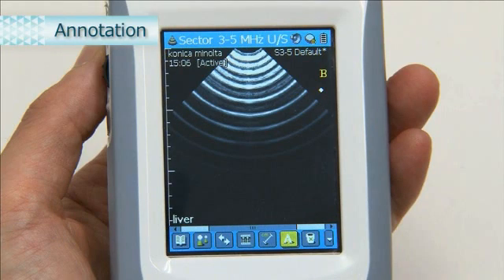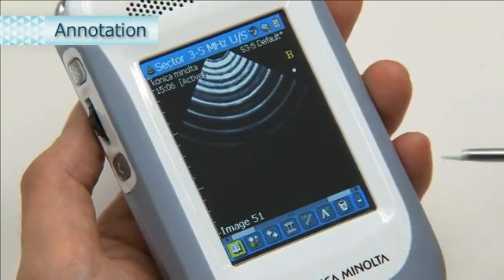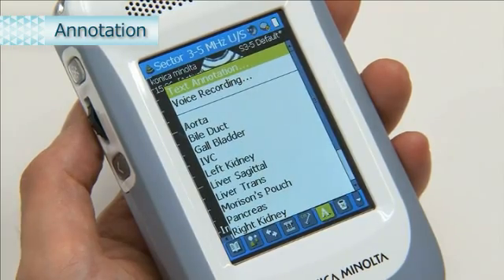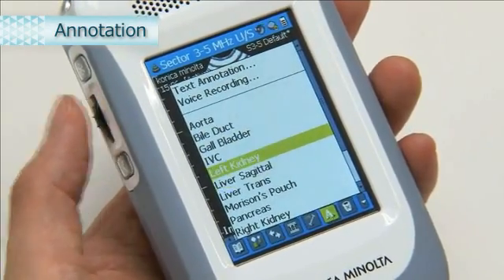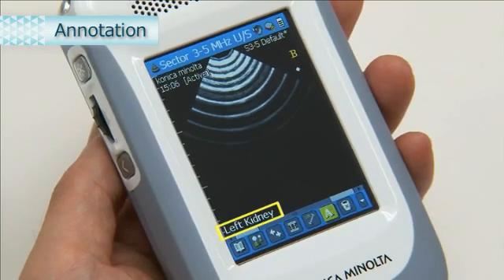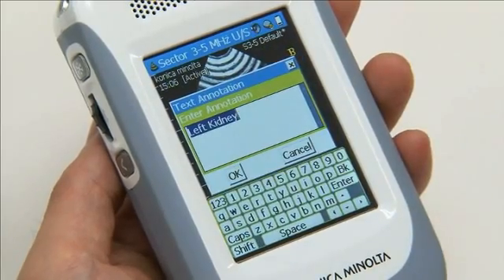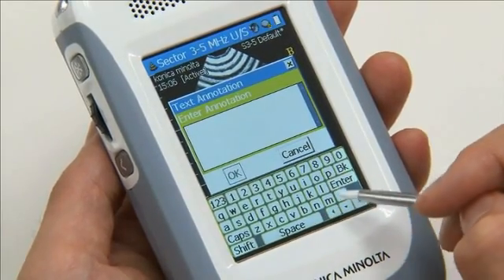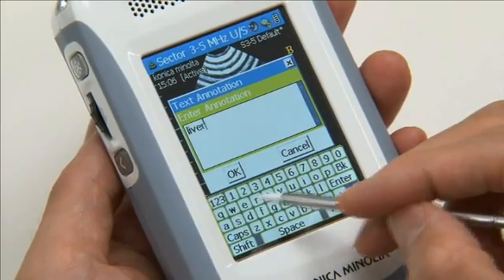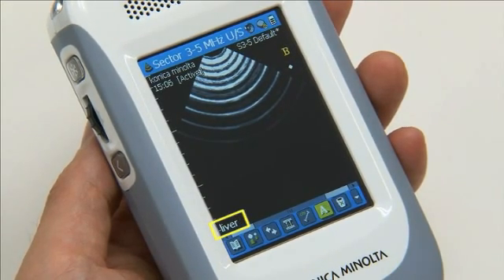We will now explain the annotation feature. Use this feature to add text and voice messages to still images. From the toolbar, select the annotation icon. A pop-up menu appears. If you wish to enter any of the comments that appear in the list, you can select it. To enter a comment manually, select Text Annotation. Enter the desired text in the text input screen. When text input is complete, select OK to return to the exam screen. The text you entered is displayed.